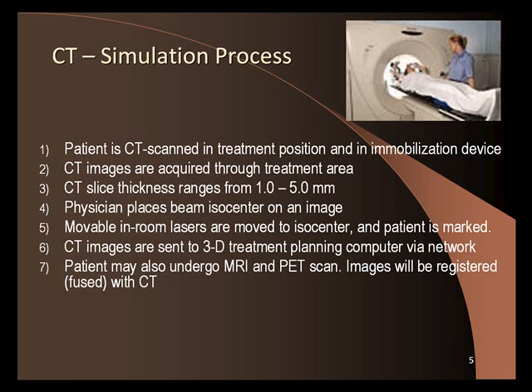Now, just a quick overview. MRI is for imaging soft tissue. So basically, MRI gives you soft tissue contrast.